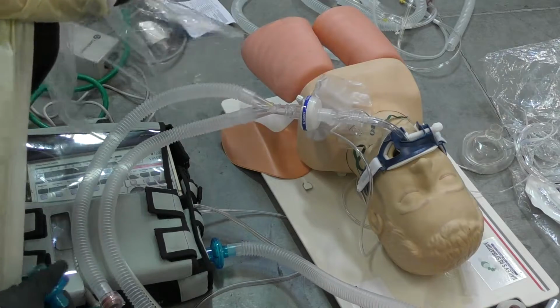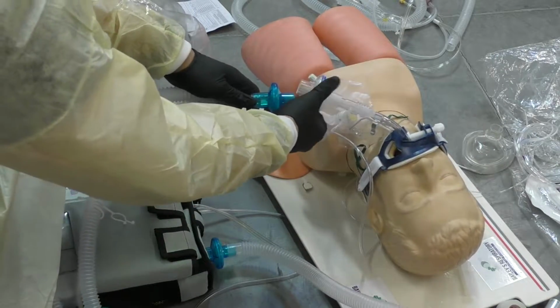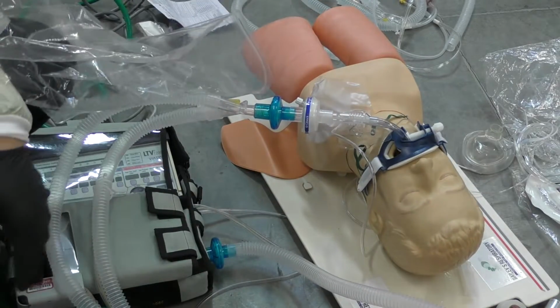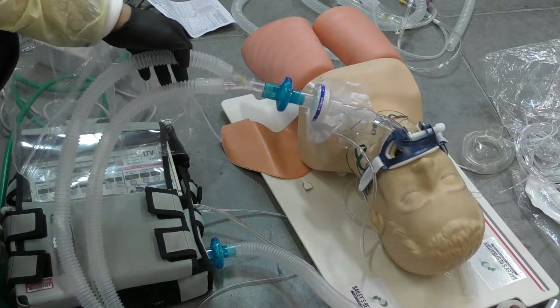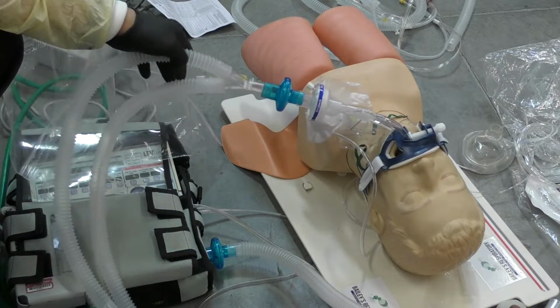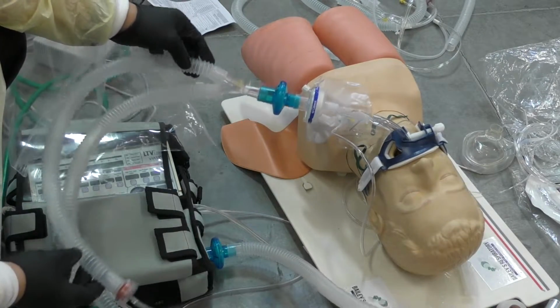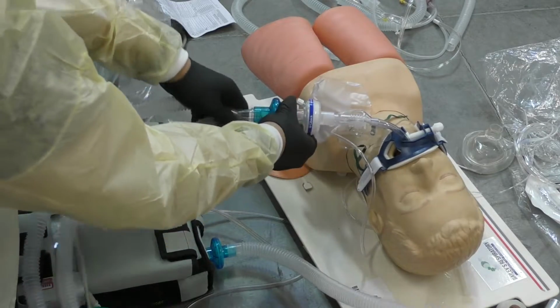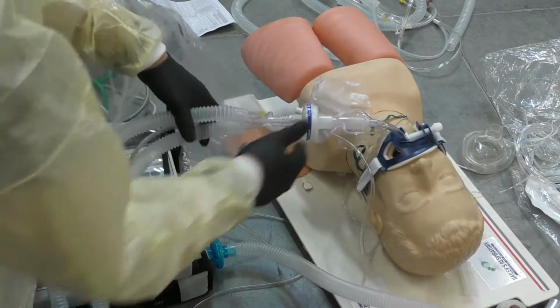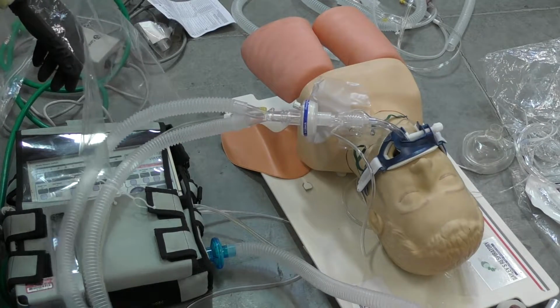If you don't have one that's a combo, you may have to chain them. The thing about that is it'll create some airway resistance for the patient. So you're going to have to work with it and do the best you can, but we're really trying to protect everyone because we're blowing this out to ambient air. So if you get something like this, it'll probably help. But just do the best you can. Remember, we're all about doing this safely.